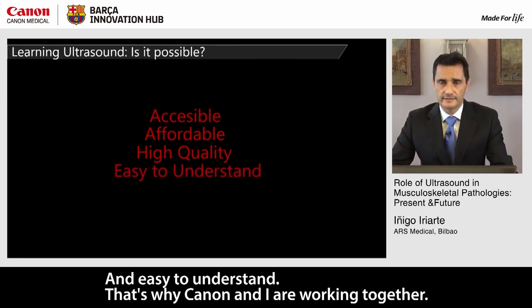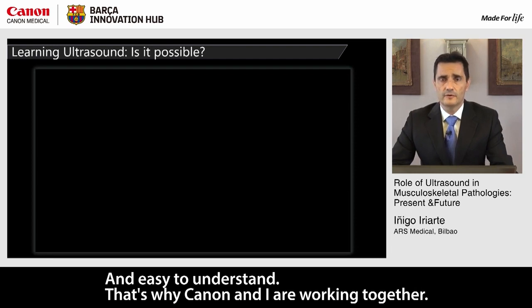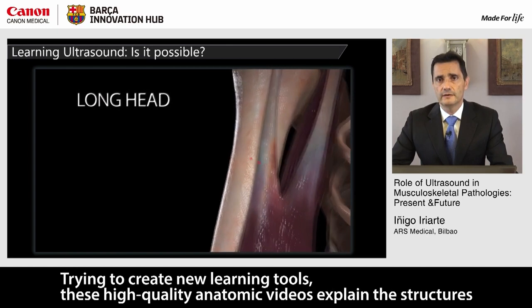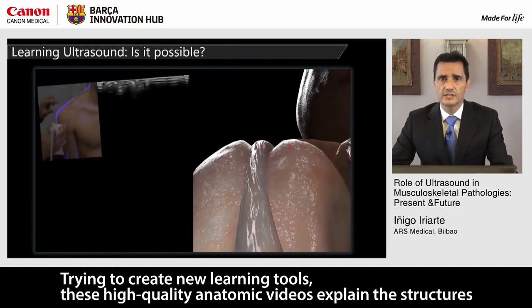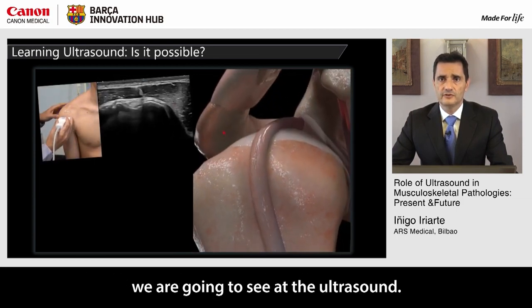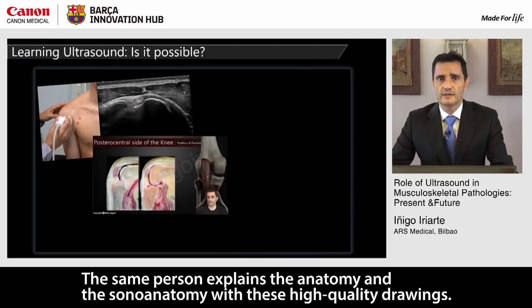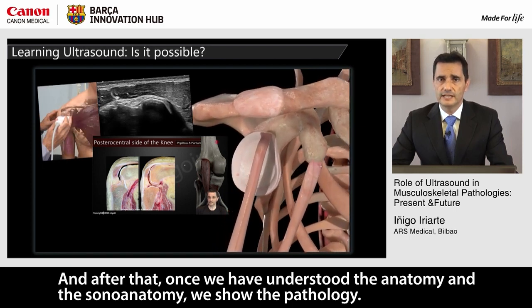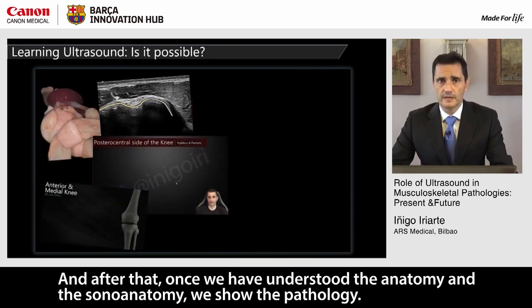And easy to understand. That's why Canon and I are working together, trying to create new tools, learning with these high quality anatomic videos explaining the structures we are going to see at the ultrasound. The same person explains the anatomy and the sonoanatomy with these high quality drawings. And after that, once we have understood the anatomy and the sonoanatomy, we show the pathology.